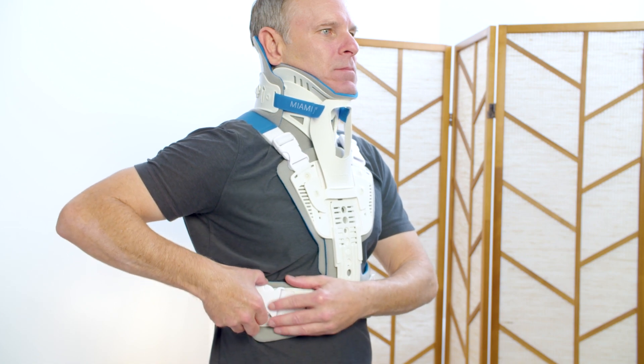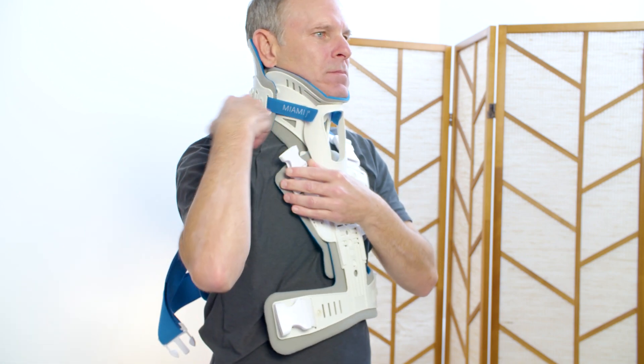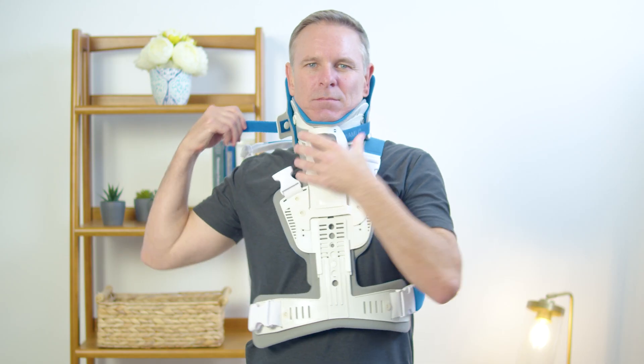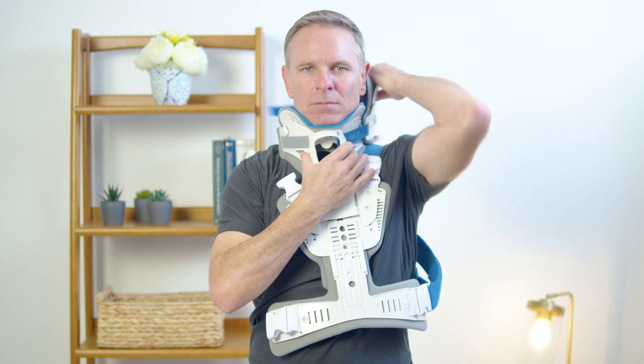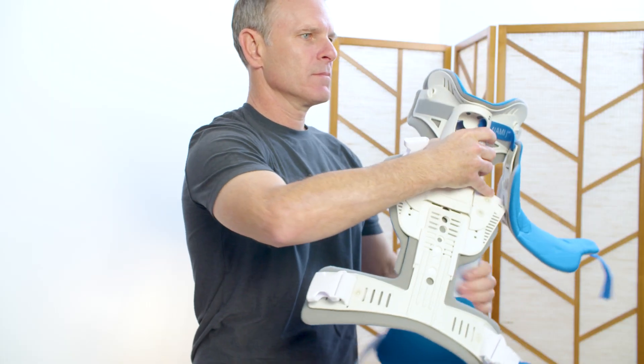Undo the waist and shoulder buckles of the thoracic extension on one side only. Next, undo one side of the cervical collar on the same side as the shoulder and waist buckles. Note: undoing one side only will help when reapplying the device.